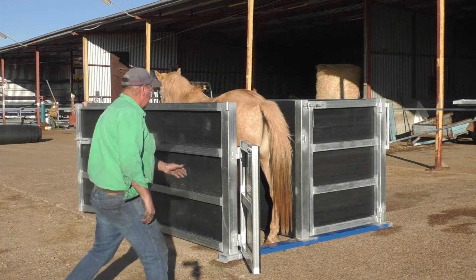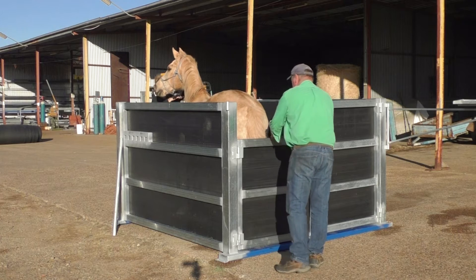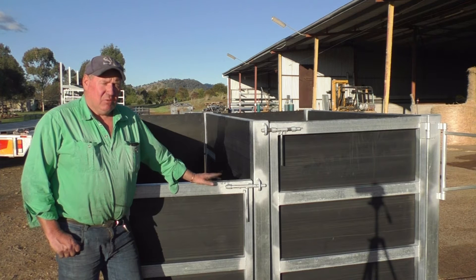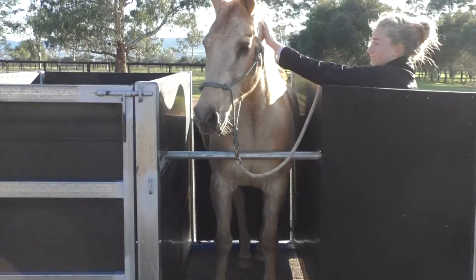I'm Stephen Owen. This is one of our standard mare and foal crushes. They're made out of all galvanised steel. They're very strong and they've been proven in Australia now for over 20 years, probably with over 40,000 horses going through our crushes per year. Vets love them, the owners love them, and it's safe for the horse and the vet.